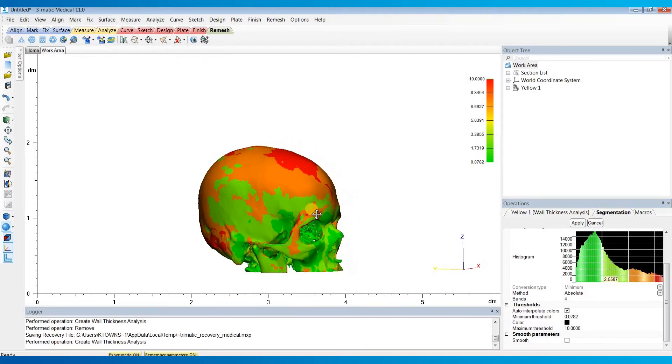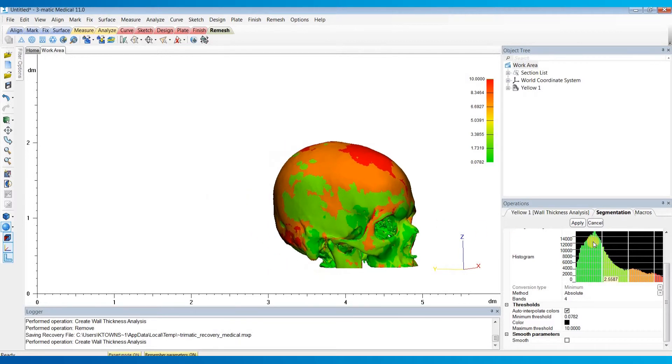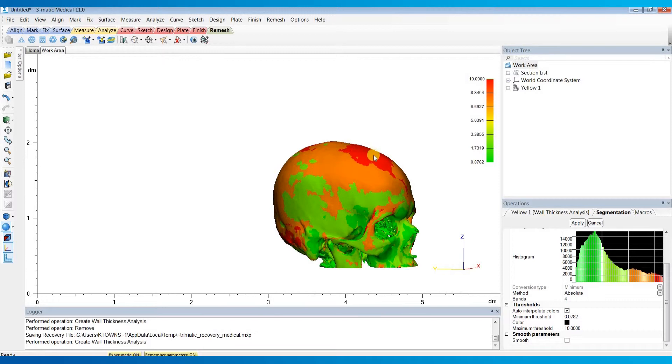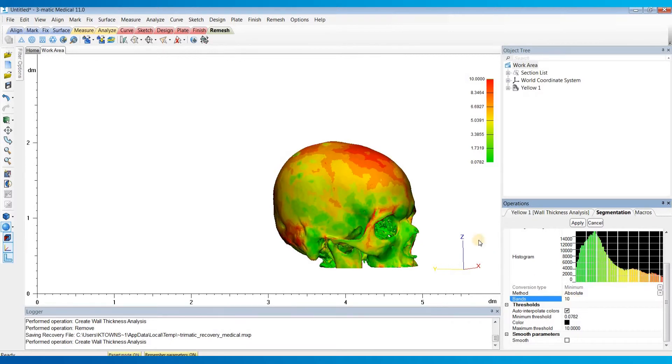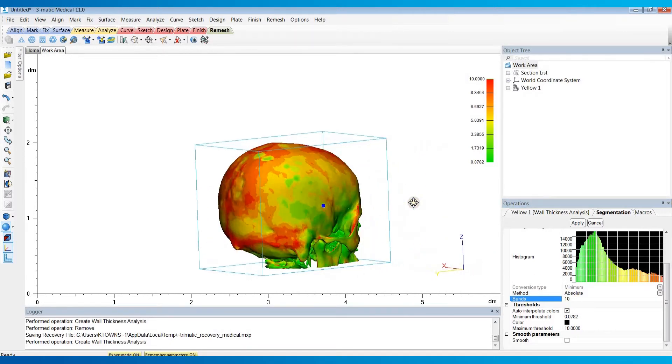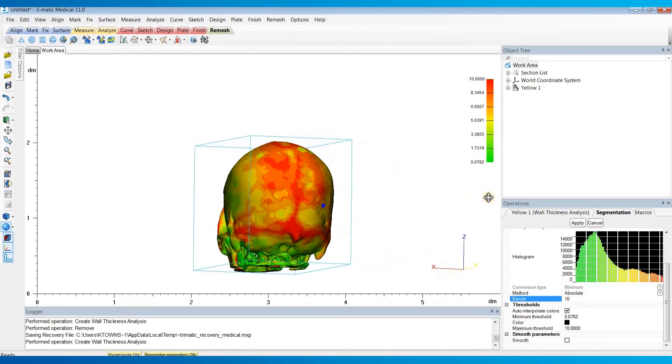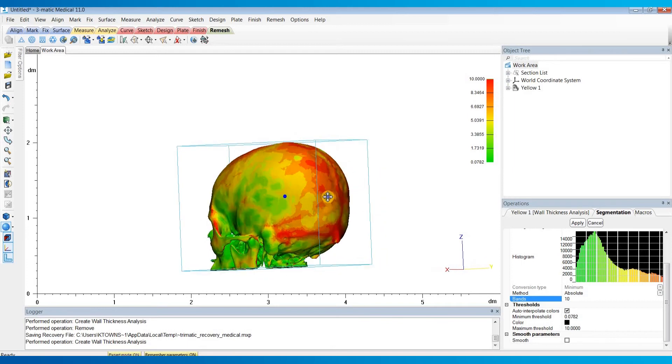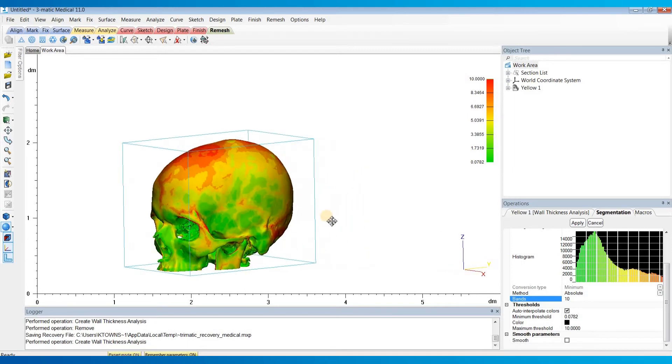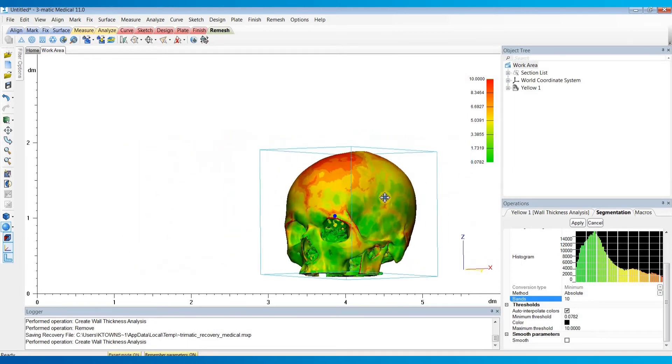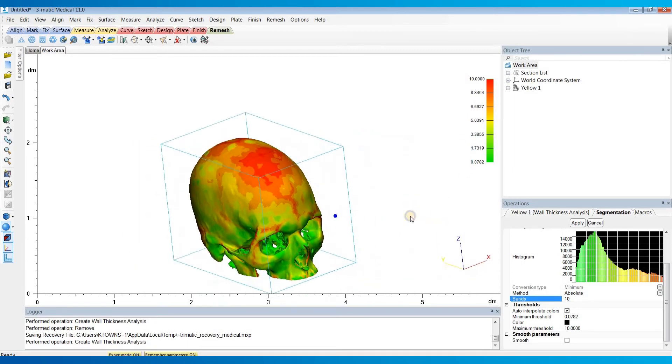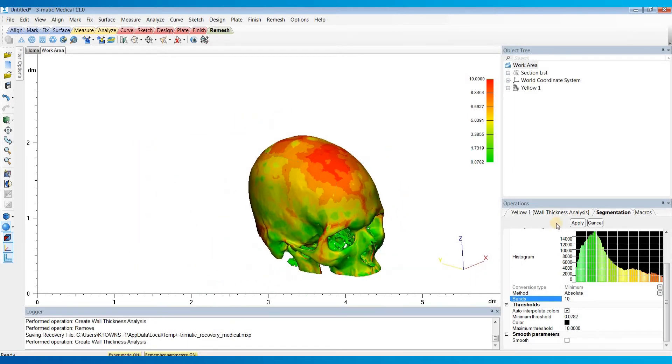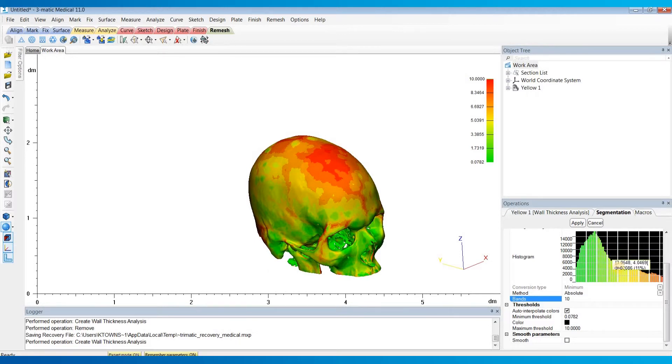So here you can see the green is all of the lower values, and then the orange is kind of in the middle, and then red is higher. So if you want to increase the number of bands, you can do so. So let me just set this to maybe something like 10, and then hit Enter. And you can see it looks more like our original thickness map as you increase the number of bands. And you can also drag these sliders if you want to increase the range for each individual band.